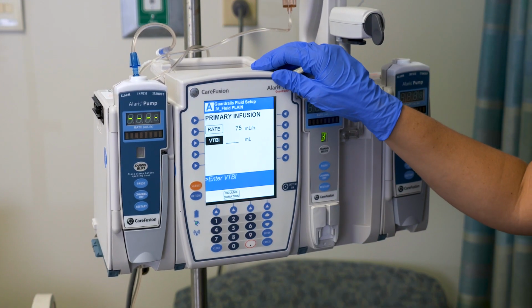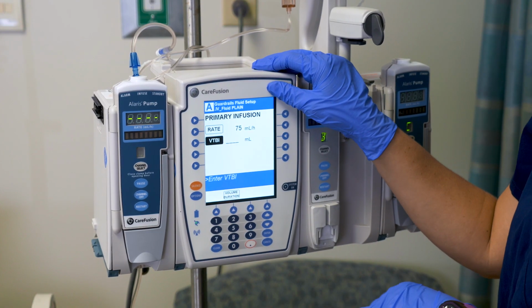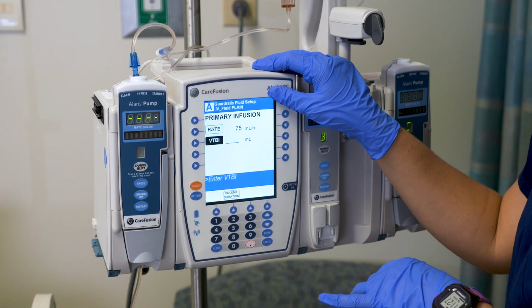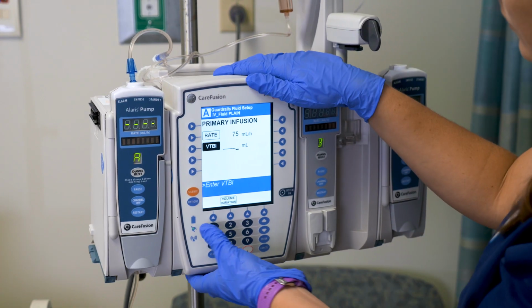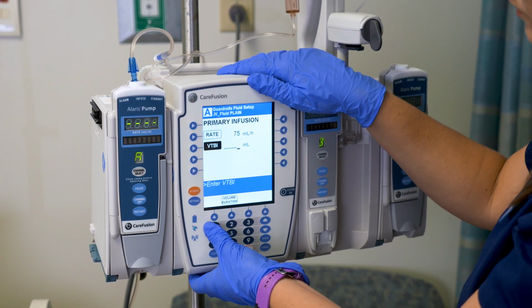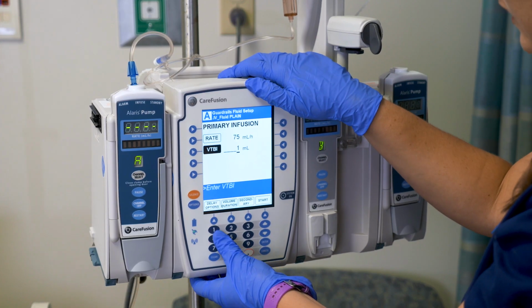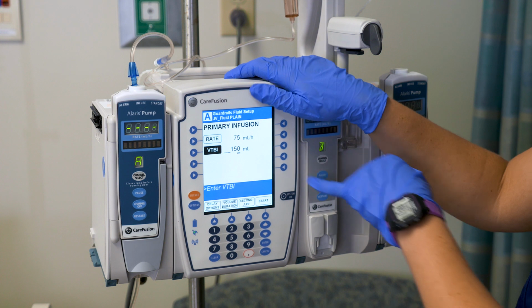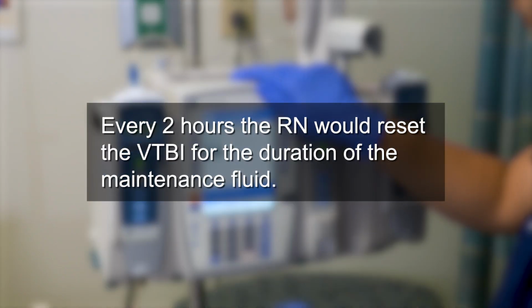My volume to be infused, that's how much I want the pump to infuse. This can vary depending on where you work. Some hospitals will only allow you to place 4 hours worth of fluid. So the unit that we're on requires us to only put 2 hours worth of fluid. So we're going to go ahead and set this for 150 mLs. So in 2 hours, this IV will beep telling us that the infusion is complete.